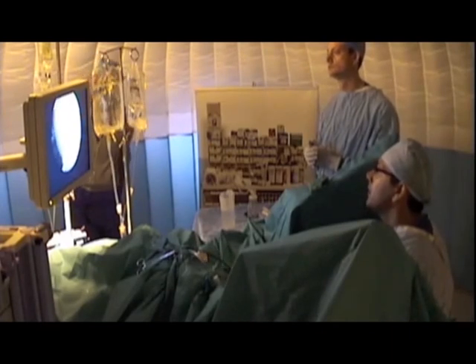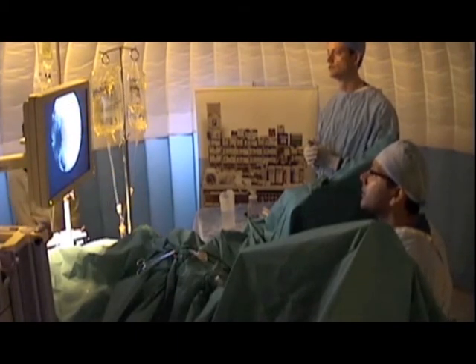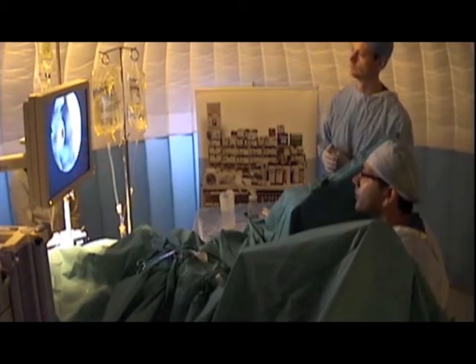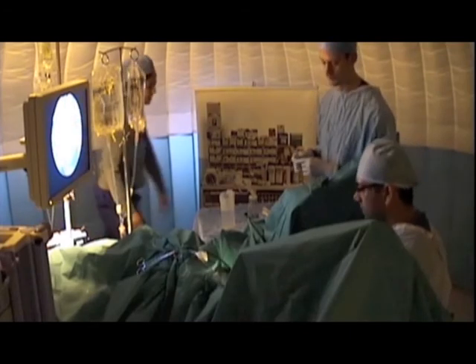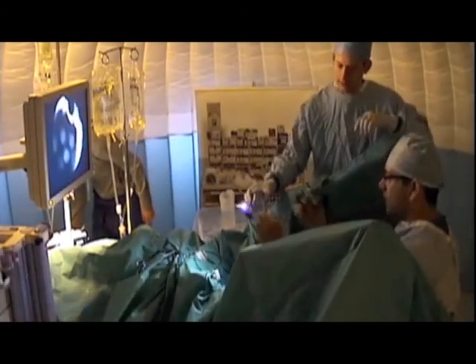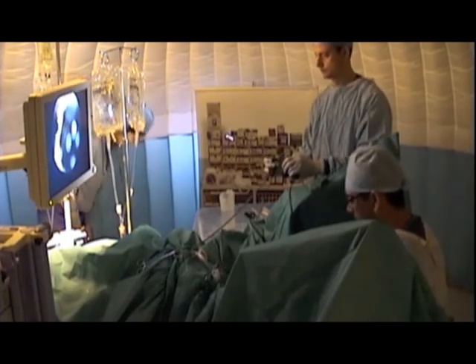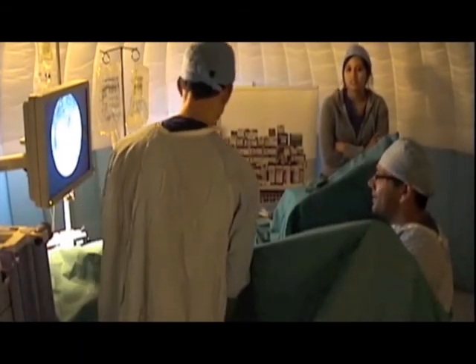I've got to be slightly careful in terms of being in there. I might as well do some other things. Should I clean it? Yeah, thank you very much. And then I'd like to have a three-way cap there.